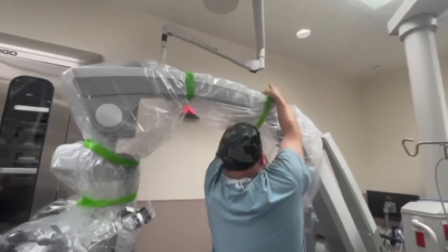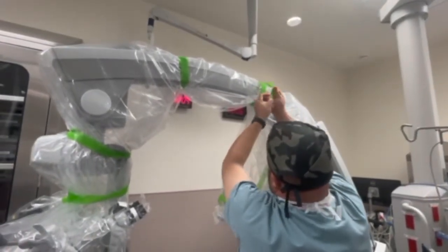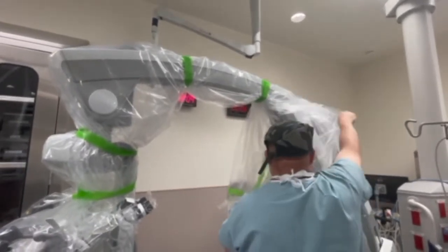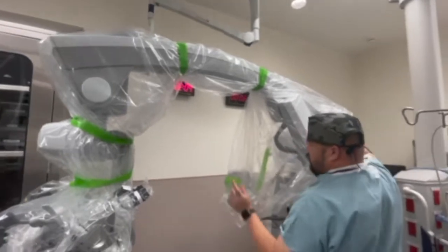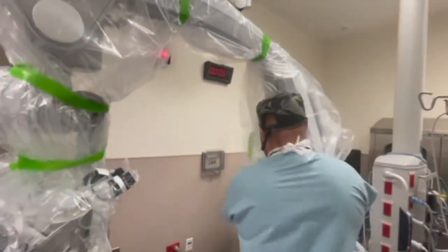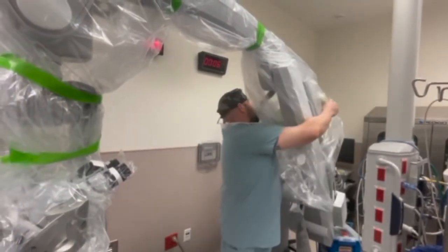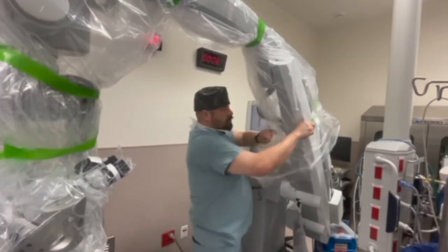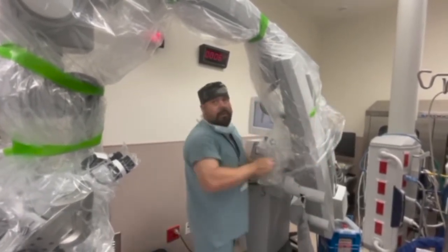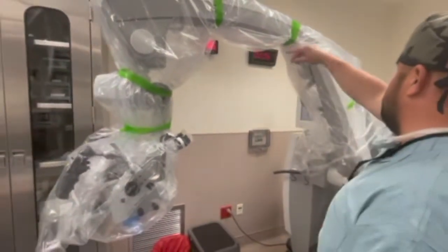If you're able to drape the scope like I'm doing it, that means I have good enough room to do the last one. So sometimes if you don't do it right, the nurse is gonna help you. But right now I think I got it and I can do it myself. Like right about there, as you can see. Okay, so that's it right here, guys. That's how you drape it like this.